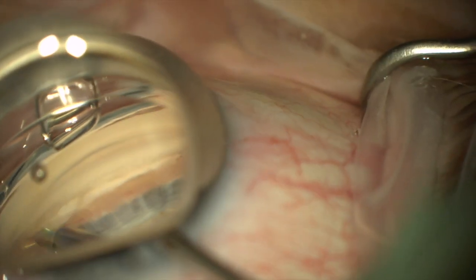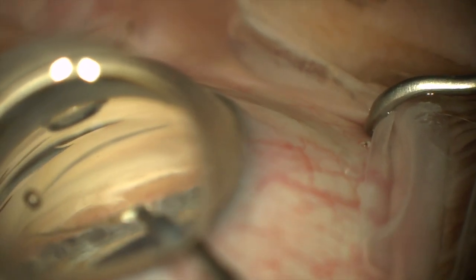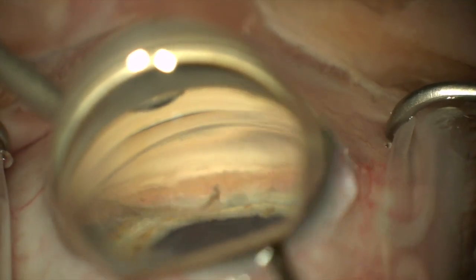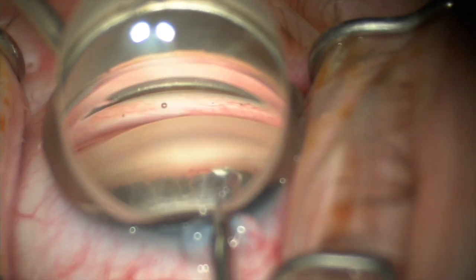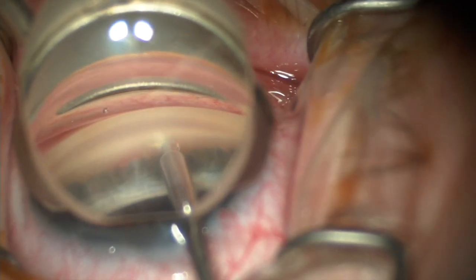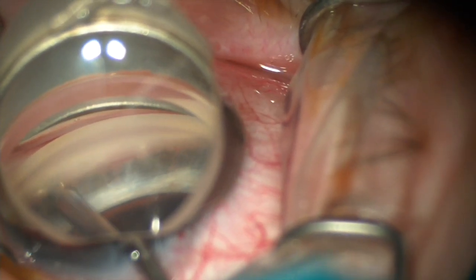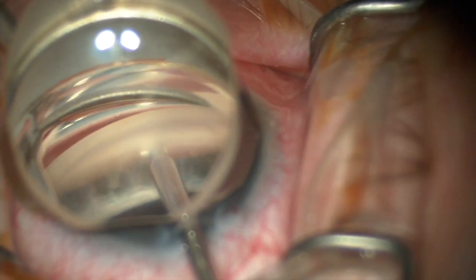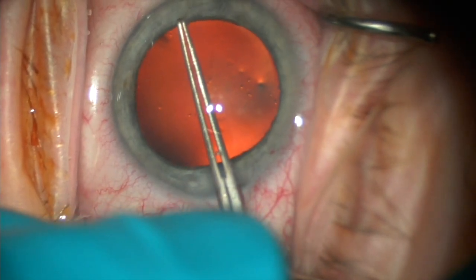Incision size is ideally 1.8 millimeters, but I think it works just fine through a standard phaco wound. Just check out this really nice long TM strip — you'll see pigmented and non-pigmented TM thanks to that trapezoid. Irrigation does obviate the need for viscoelastic, though I would recommend using it in the beginning as you get used to moving in and out of the eye with this sharp blade. You have aspiration available if you need it for blood, pigment, or even a strip in your view.